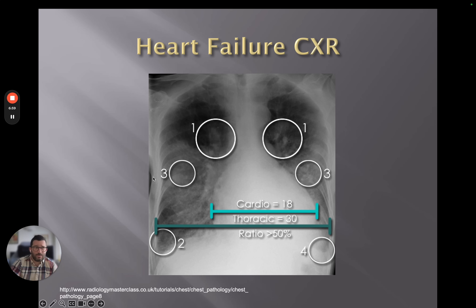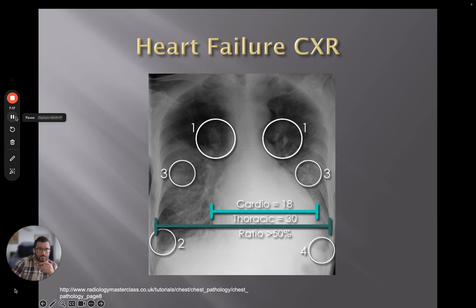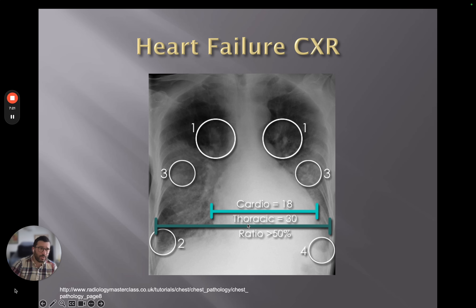This airspace shadowing is due to alveolar edema, where the interstitial shadowing progresses to the point where the tissue becomes overwhelmed. Patients in cardiac failure can also develop pleural effusions. Putting all this together, we can create a picture of cardiac failure from the appearances on the chest x-ray.